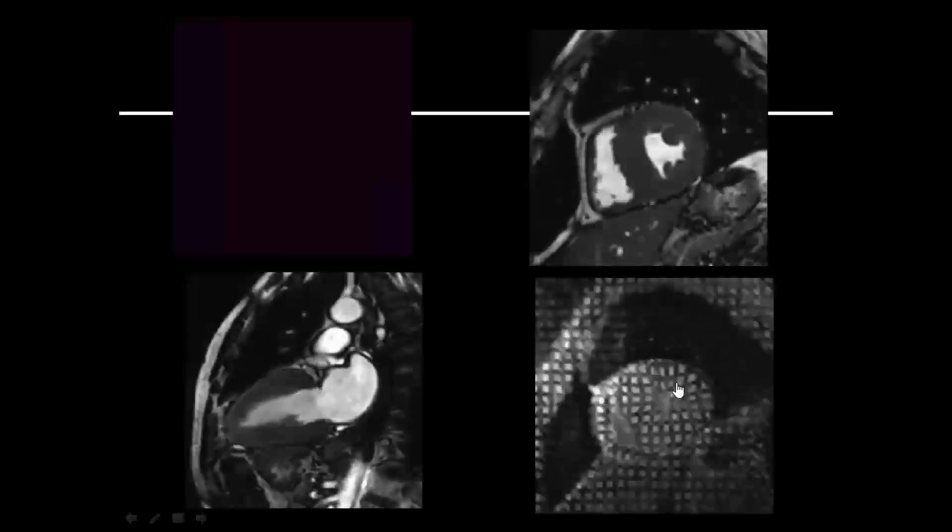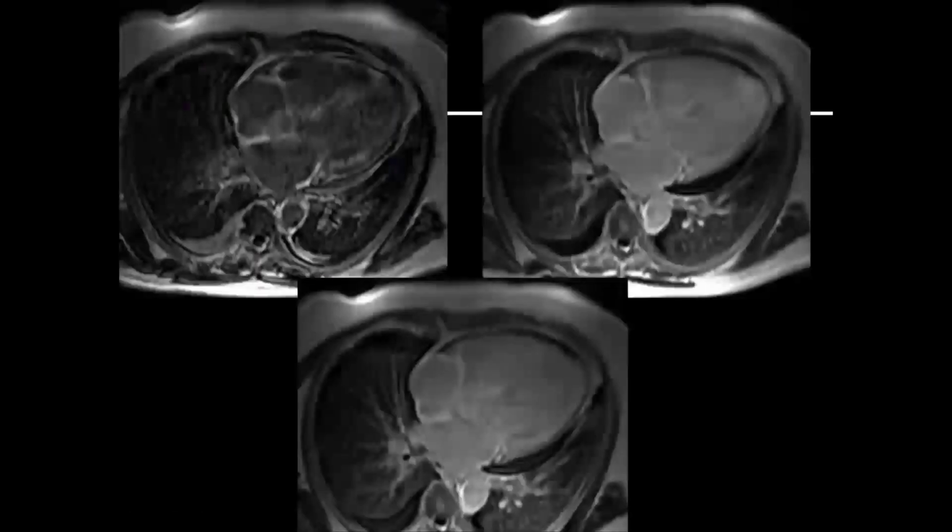Tagging technique, we put these tags, or you see these squares. Some of these are contracting and some of these are not contracting. That would tell you that this patient has some form of restrictive cardiomyopathy. And actually, through computer software, we can measure these tags and it can give us detailed information about the diastolic function of the heart. But it's still the echocardiography, which is much better than MRI in measurements of diastolic function.